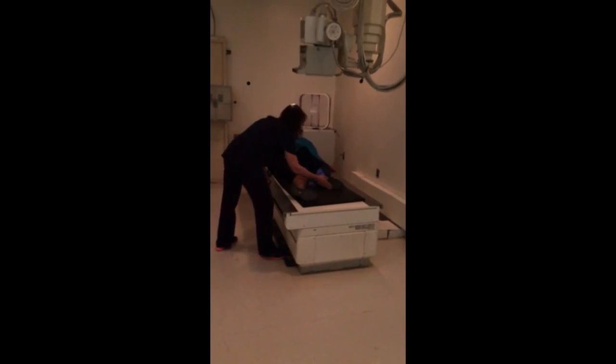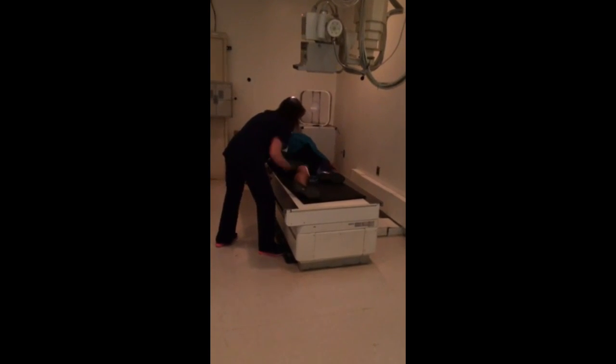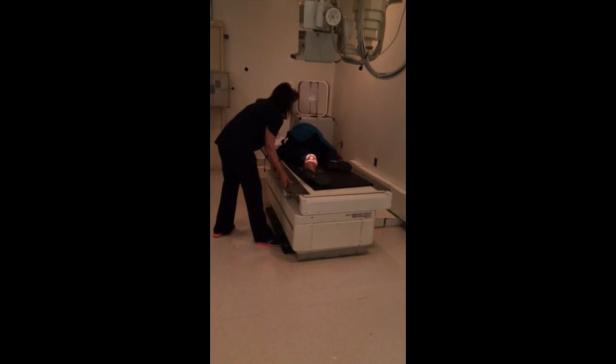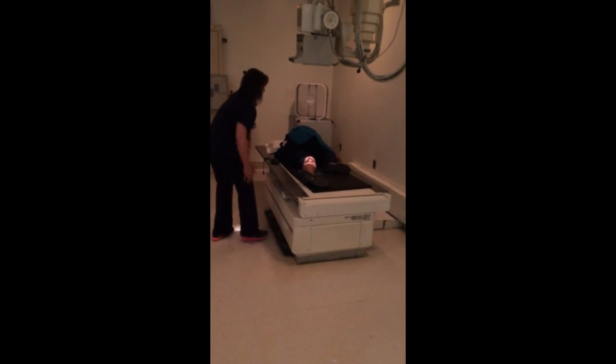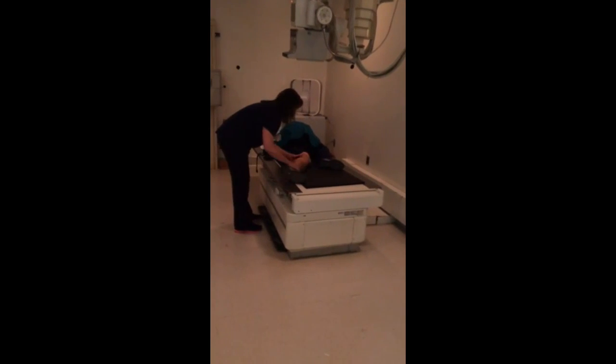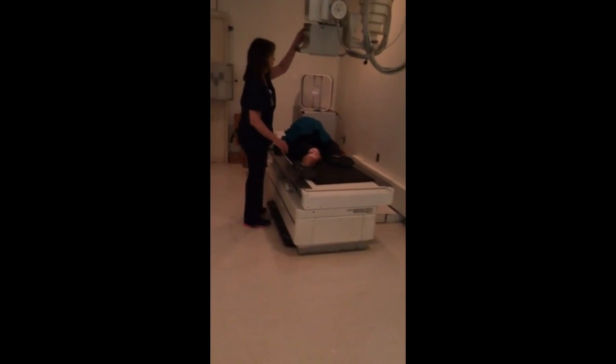Can you bring this leg up a little bit more? Are you comfortable? Sure. There we go. Perfect. My central ray enters 1 inch distal to the medial epicondyle. My leg is bent 20 to 30 degrees.